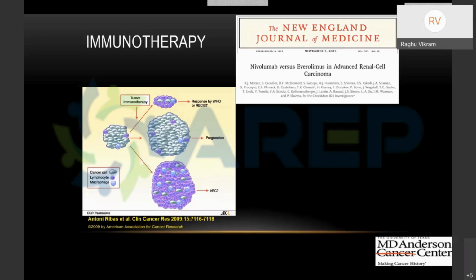And also another thing that I did not bring up in my talk, there are a lot of studies which actually looked at cystic renal masses. One of the largest came from NYU, where Martin Bosniak used to work. They found that most cystic renal cell carcinomas, or almost all the cystic renal cell carcinomas, are indolent. That means they never found even Bosniak category 4 cancers, if they really categorized it, really, that means it was truly a cystic lesion with a solid component, Bosniak 4.